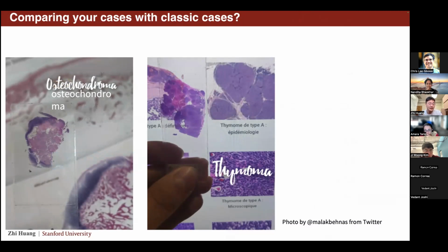For example, maybe a pathology search engine, just like Google, that allows clinicians to match the case on their hand, the glass slide case, to ones they have gone over before, or ones in the textbook. Pathologists typically compare their cases during their work to the classic examples. This is how they learn and become better at their job, and the more cases they see, the more they learn.